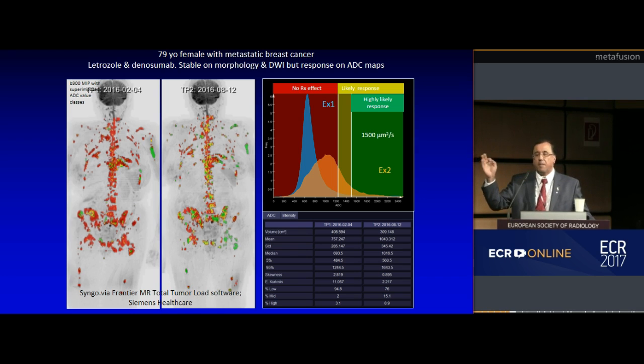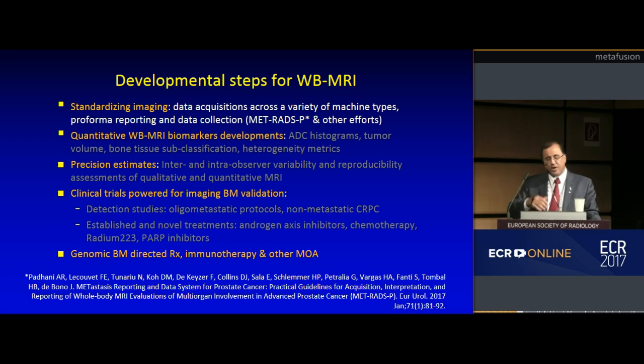Not only do you see the shift of the histogram, but if you back project it, you can see that there are areas of cell kill and of viable tumor all intermixed, right? This is typical apoptosis. When you look down a microscope, that's what you see. You see a cell die here, another one die over there, and then the rest of the cells are viable. This is exactly what happens. And that's what you see also on your pictures.